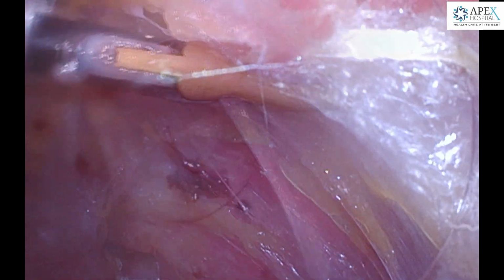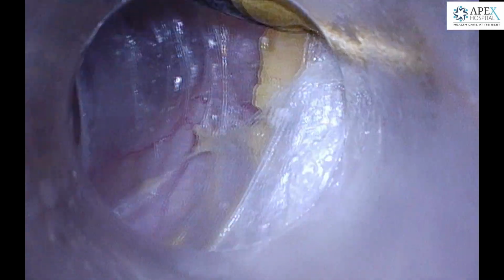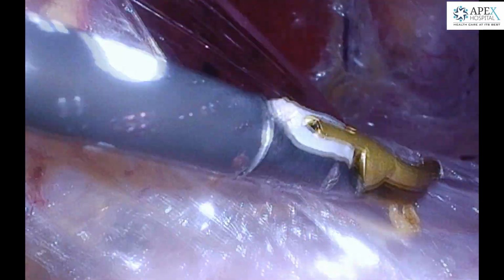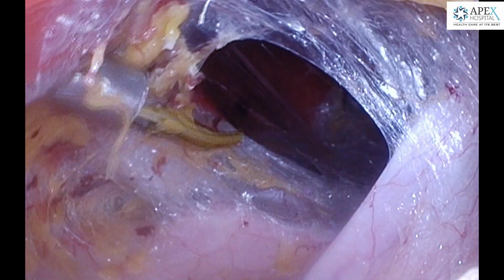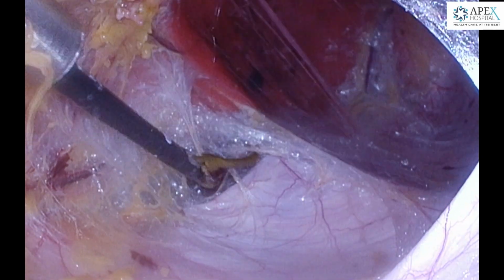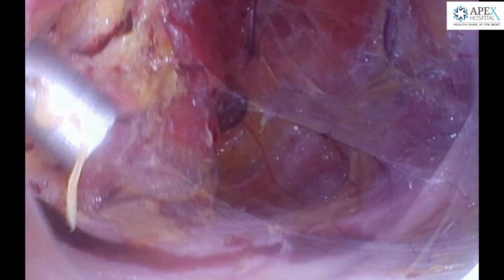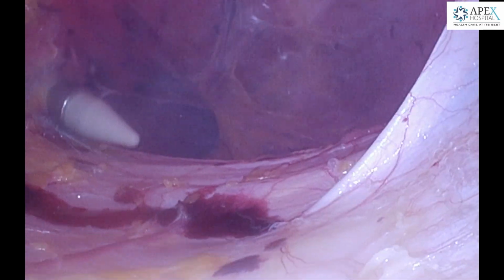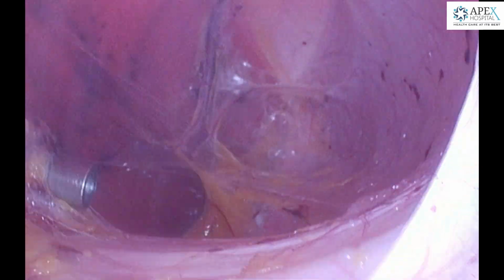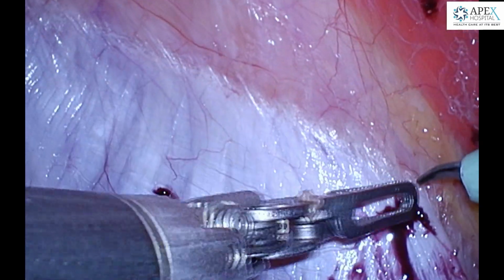The first trocar is placed at the lateral border of the left rectus muscle, and a bipolar shear has been introduced laparoscopically to create further space for insertion of the camera port and the arm 2 port. The entire left rectus muscle is mobilized from the posterior rectus sheath so that there is enough space for the robotic instruments to work.